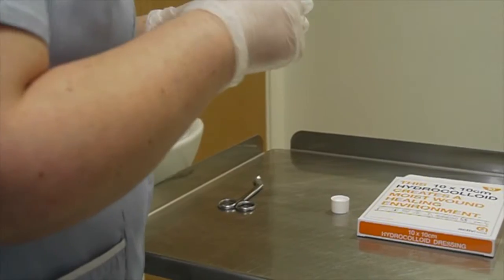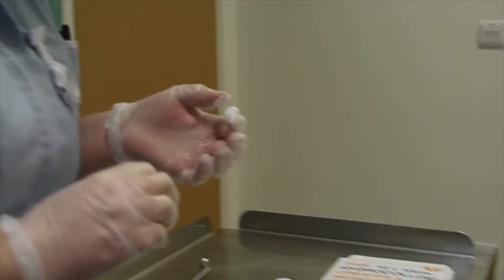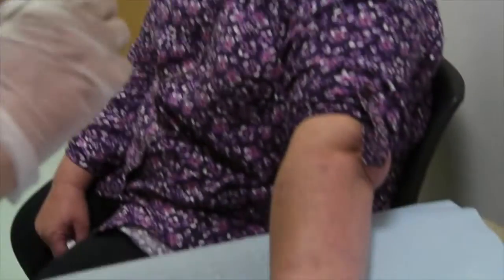The nurse is wearing gloves to prepare and apply the ointment for health and safety and infection control reasons, but you won't need to do this if you're doing it yourself.